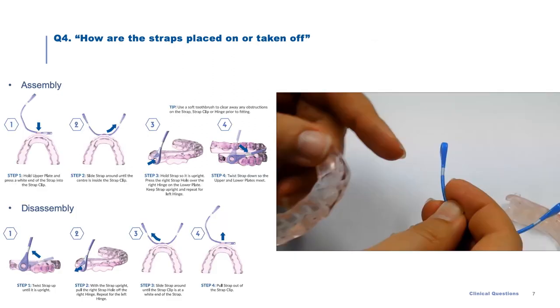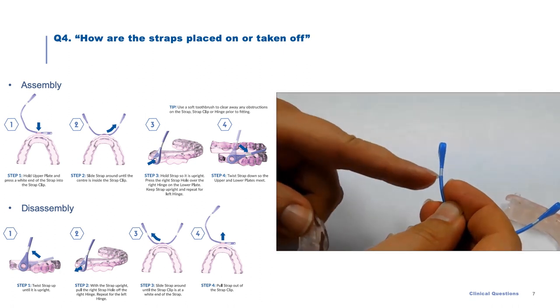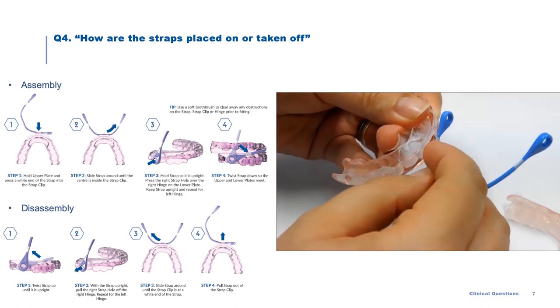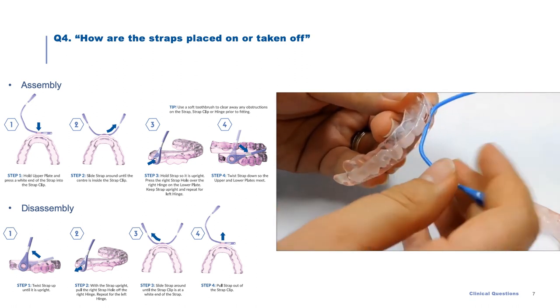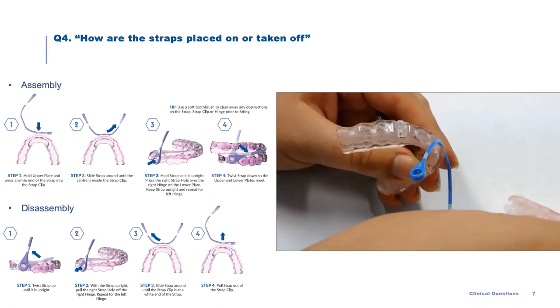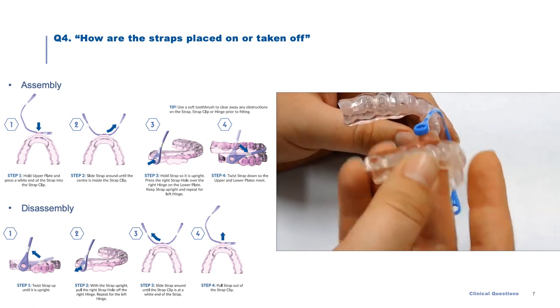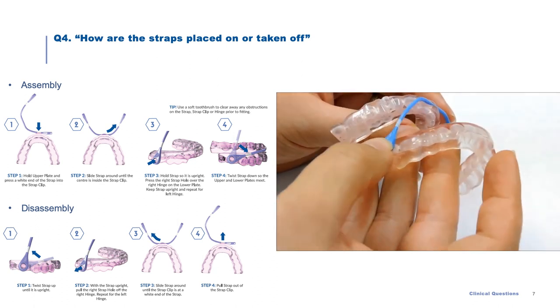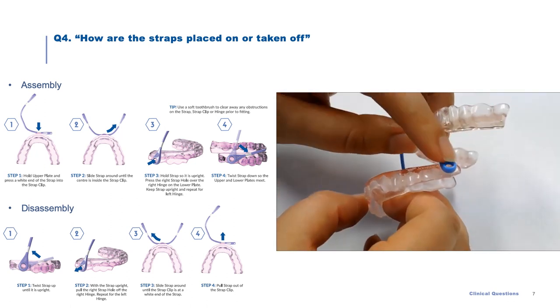How are the straps placed on or taken off? To attach a strap, hold the upper plate and press the white collar of the strap into the strap clip. Slide the strap around until the center is inside the strap clip. Hold strap so it is upright. Press the right strap hole over the right hinge. Hold finger over the right hinge and repeat for the left hinge.